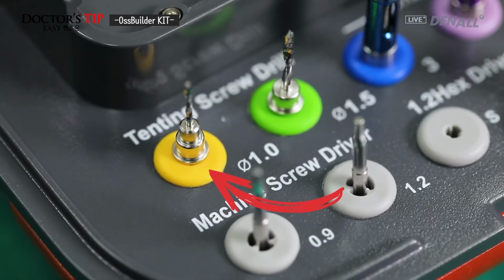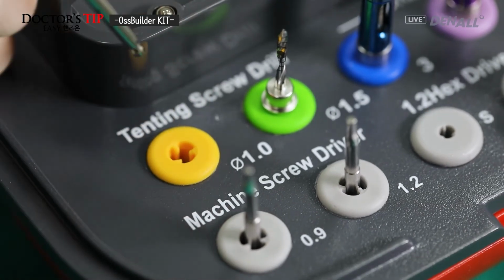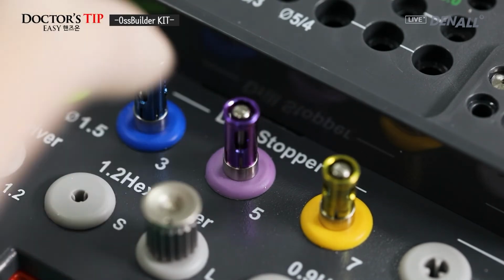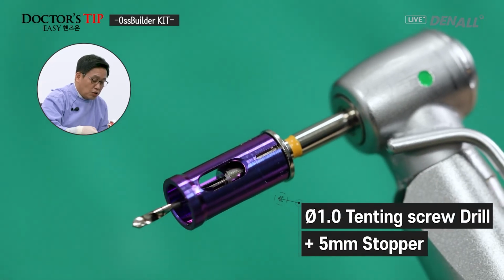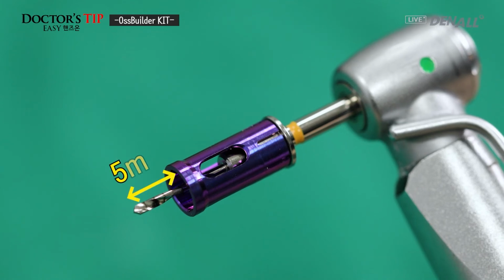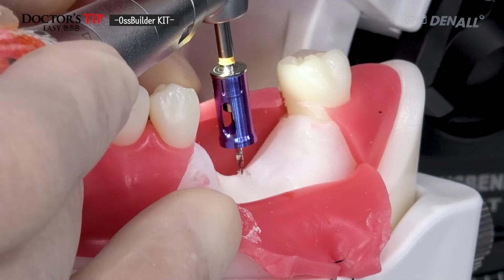Before you do tenting screw, choose tenting screw drill diameter 1.0 and choose 5mm stopper, and the drill length will be 5mm. Diameter 1.0 drill and 5mm stopper will be connected, and as you can see, the drill length is 5mm. Safe drilling is possible, as you can see in the marked area.